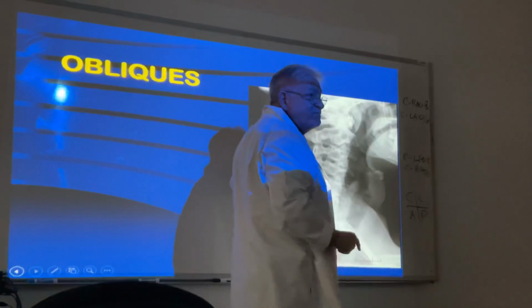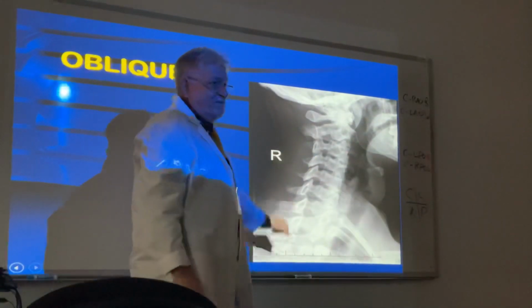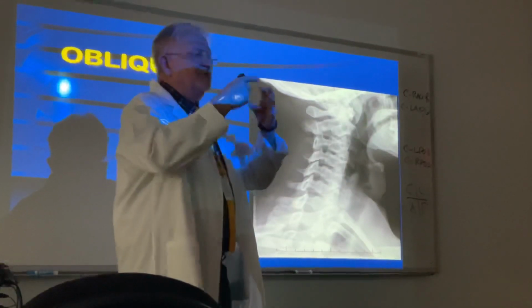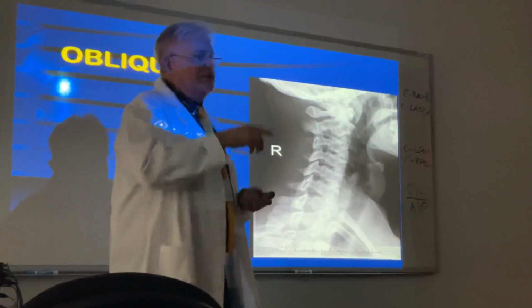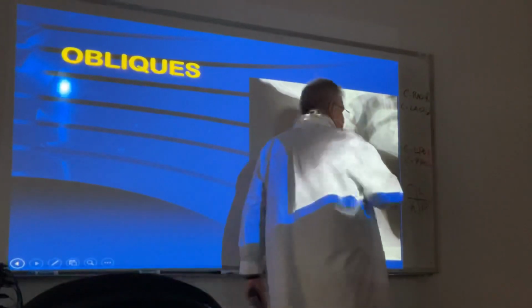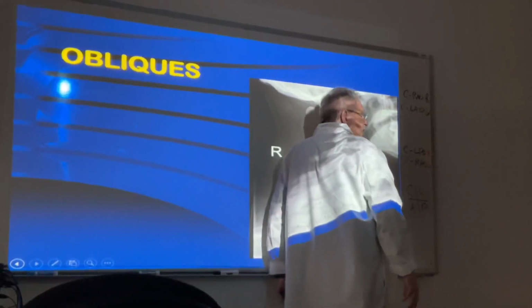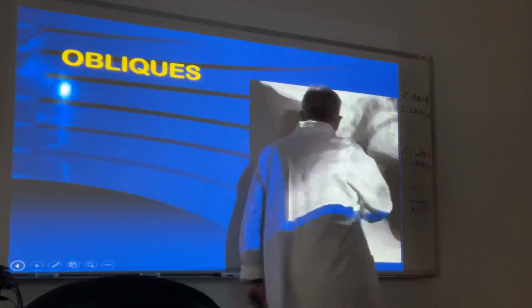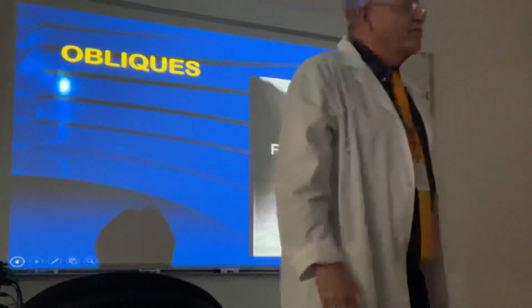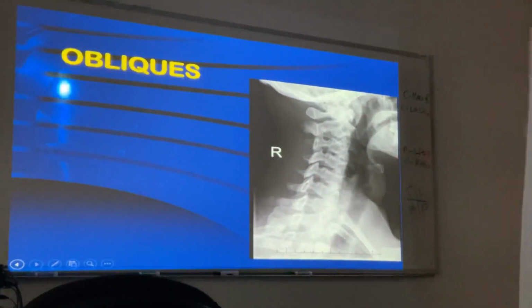That's why I got confused in my head. I'm saying we can figure it out, but the definitive way is to ask somebody, was this against the wall? Now I know they do left anterior obliques. The problem was they chose the wrong marker. I wasn't sure if there's X-rays that flip the picture, but anyway, I just figured it out. Thank you for clarifying. But it's not that simple.